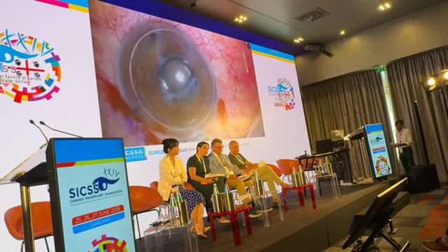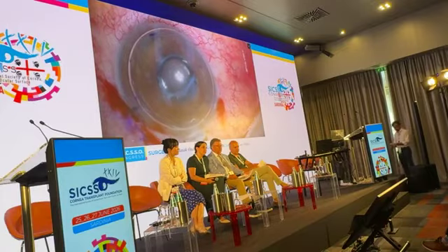So you can see the edges of the DM. This will help to center the graft. Air also helps, when there is more corneal edema, to decompress a little bit of fluid from the corneal stroma, so you see more during manipulation of donor tissue. Now you carry on. So I'll prepare the donor now.